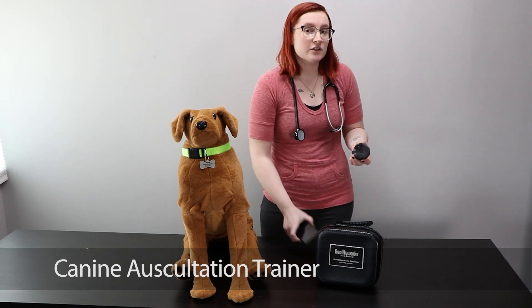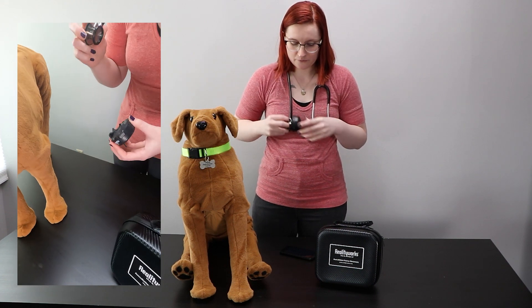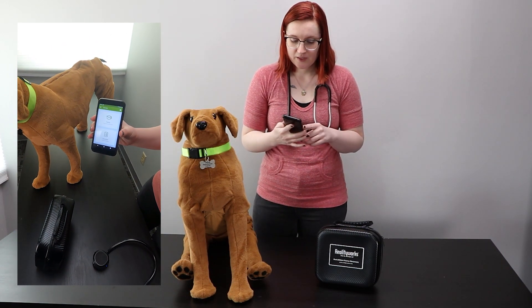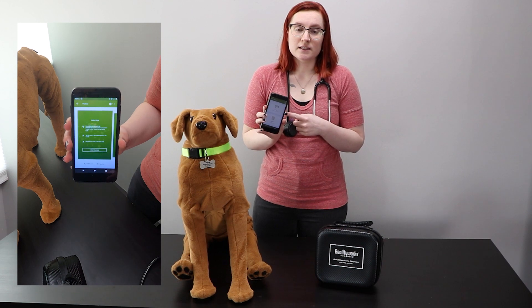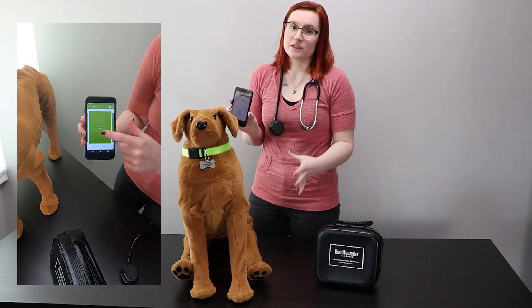Now if you want to auscultate for a sound, all you have to do is power on the stethoscope attachment, attach it to your stethoscope, open up the K9 Auscultation Trainer app and select which mode you want to work in. In practice mode, students can pick which sound they want to listen to, and they'll see a diagram which shows them where they need to place the stethoscope on the trainer to hear that sound.